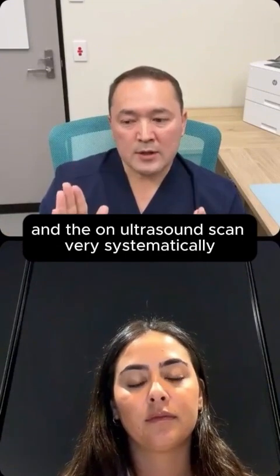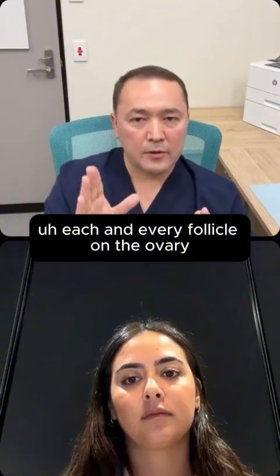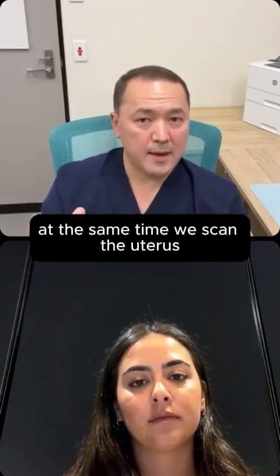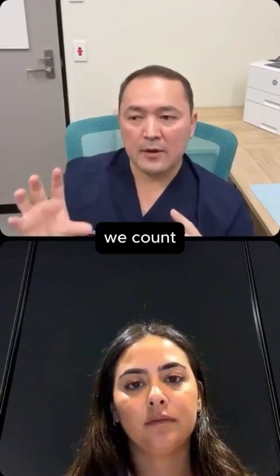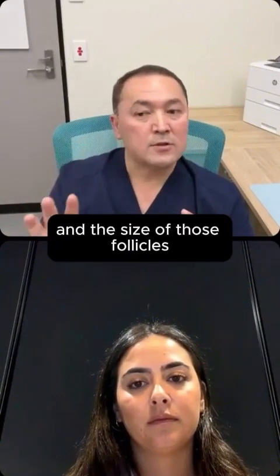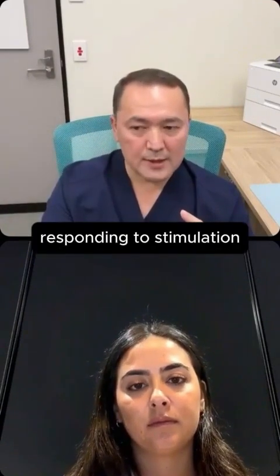On the ultrasound scan, very systematically, the sonographer measures each and every follicle on the ovary. So mainly we are interested in the ovaries. Yes, at the same time we scan the uterus, but mainly here we're interested in the ovaries. We count each and every single follicle on the ovaries and the size of those follicles. That tells us how your ovary is responding to stimulation.